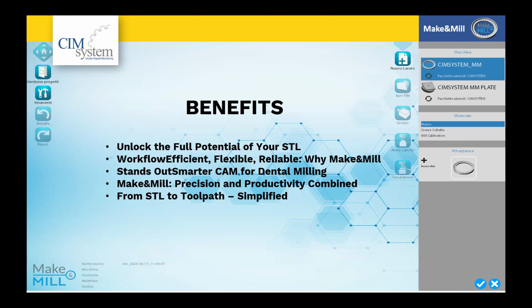The workflow is designed to adapt to different clinical cases and user needs without compromising on speed and reliability, and is both streamlined and customizable. What makes Make&Mill stand out is the intelligence behind it. It's not just about toolpaths, but the smart strategies that simplify complex tasks. With this software, you don't have to choose between accuracy and speed. You get both in one consistent integrated system. The transition from 3D model to an actual machining strategy is quick and intuitive. Make&Mill handles the complexity so you can focus on the result.